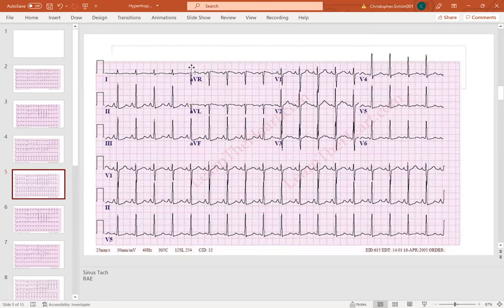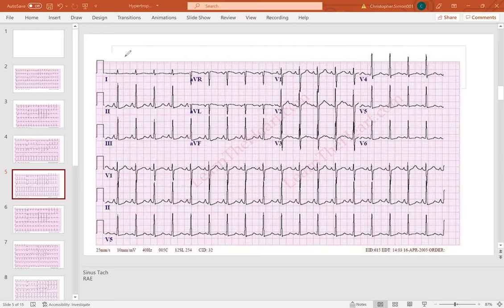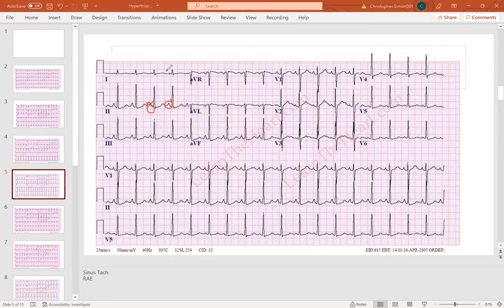Next EKG: sinus tachycardia. P-waves greater than 2.5 millimeters — right atrial enlargement. Remember to use 2.5 millimeters, not 3 — if you use 3 you'll miss some cases. The P-waves are not wider than 0.12 seconds so no left atrial enlargement. Right atrial enlargement: look at lead II only, P-wave greater than 2.5 millimeters in height. Left atrial enlargement: you care about both lead II and V1.